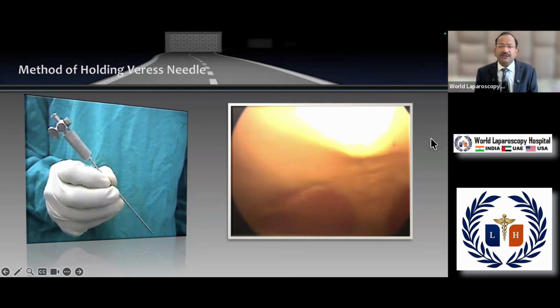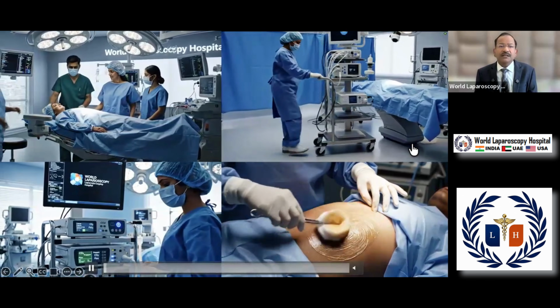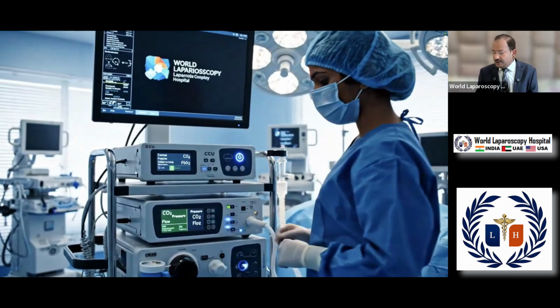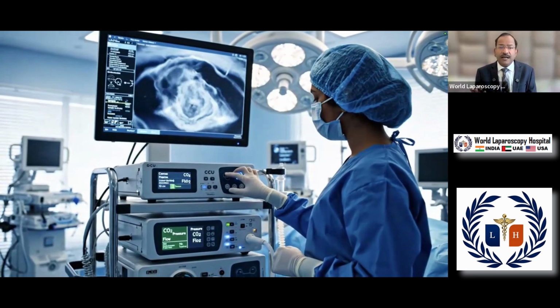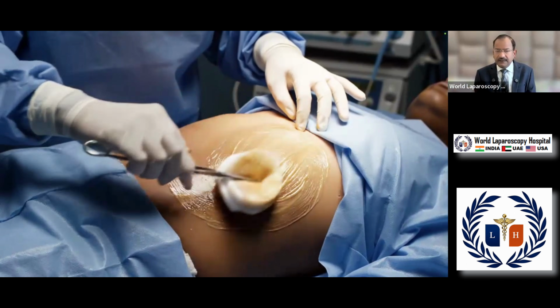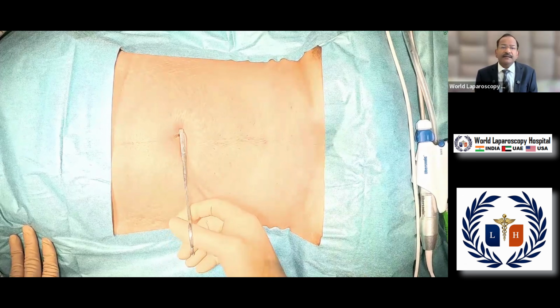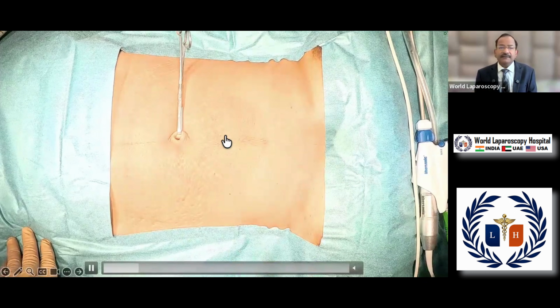So, let us start the procedure and we will see how to do. First thing what you will do, that you will bring the patient on the OT table, bring the trolley, switch on all the insufflator and the light source. Remember always switch on the insufflator before access, and then clean the abdomen nicely with the betadine, and multiple times you can use the alcohol also, and after that you should apply 2 Allis forceps either side, 1 Allis forceps this side, other Allis forceps that side.